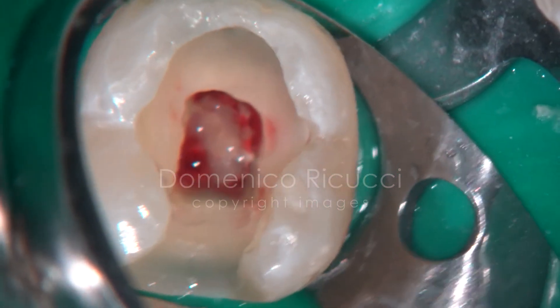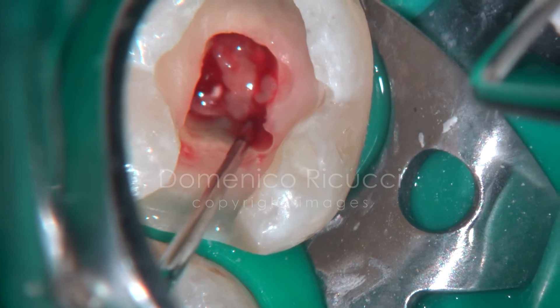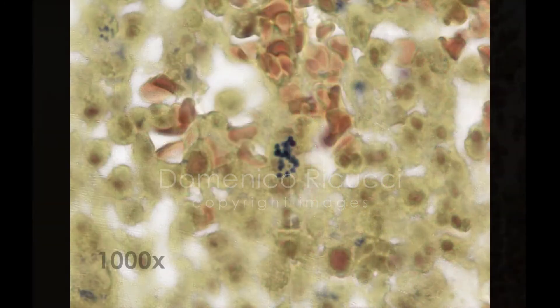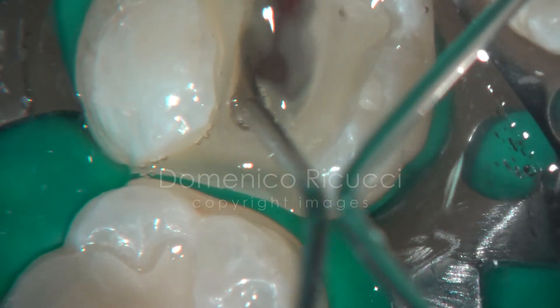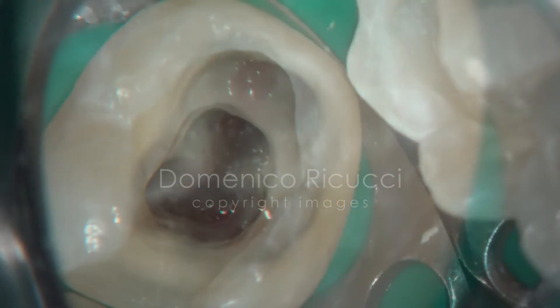The pulp chamber roof is progressively removed. We have histological evidence — unpublished — that this corresponds to degenerative changes and bacterial infection. Therefore, full pulpotomy is accomplished with the surgical cuts placed at the orifice level.